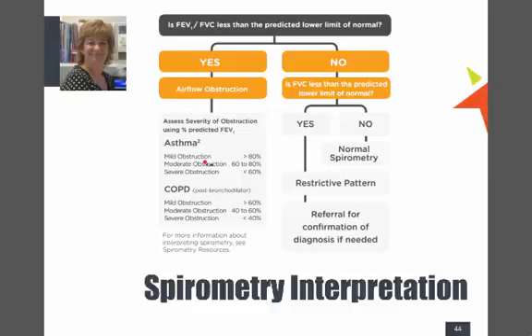If it's less than 60, you want to be starting to think about what's going on with their pulse, what's going on with their stats. Is this an asthma attack that actually requires them going to hospital? And again, I said, we don't do spirometry in A&E enough. If someone can't do a spirometry, they're in trouble. It might be 50%. That's telling me that their airways are only 50% of what they should be when they're well.